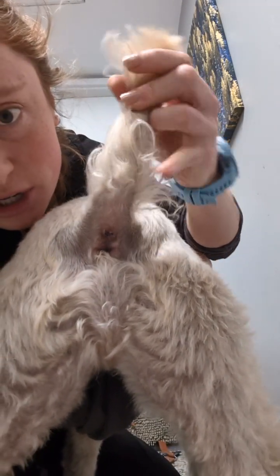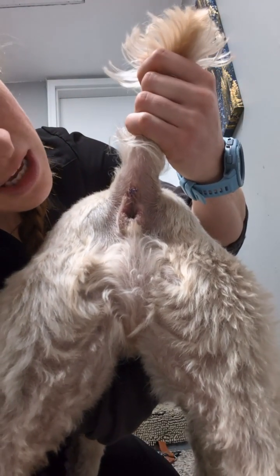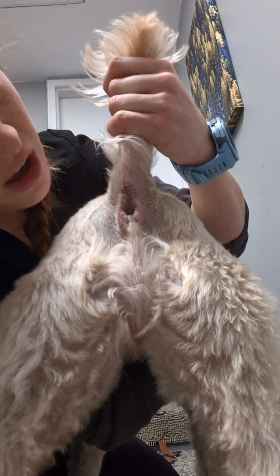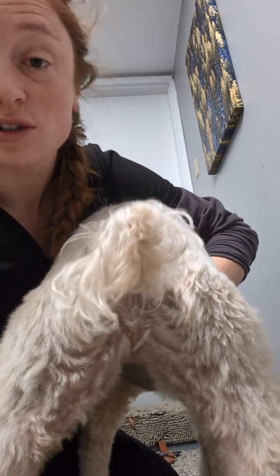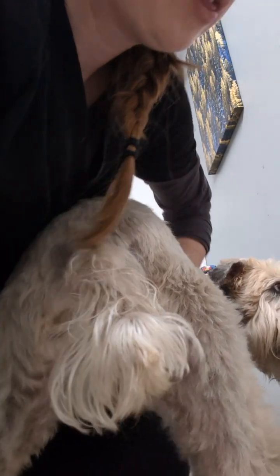You can see the suture right up there. And I'm looking for redness, swelling, any oozing, or any other debris, any darkness, any dehiscence, and like that. But this looks really, really good. So I know that it's ready to remove that suture.